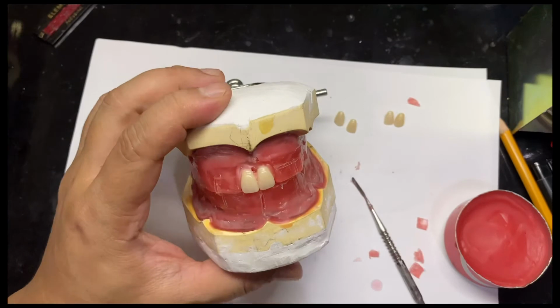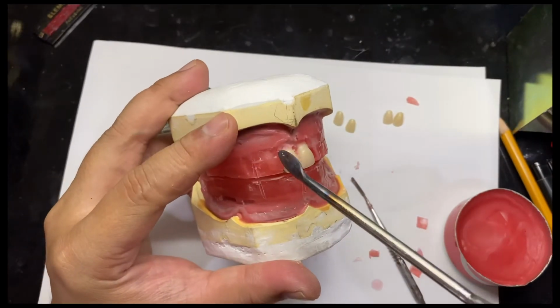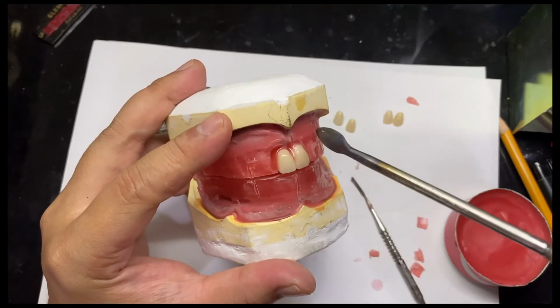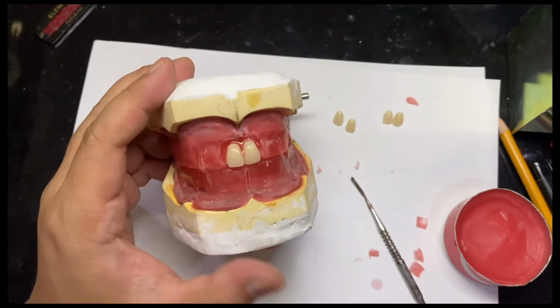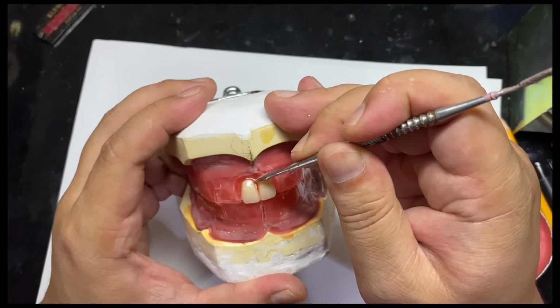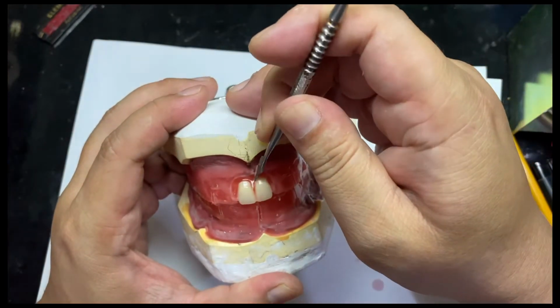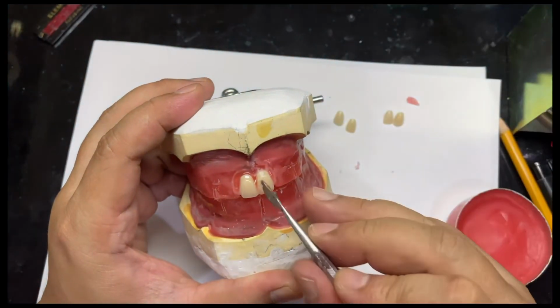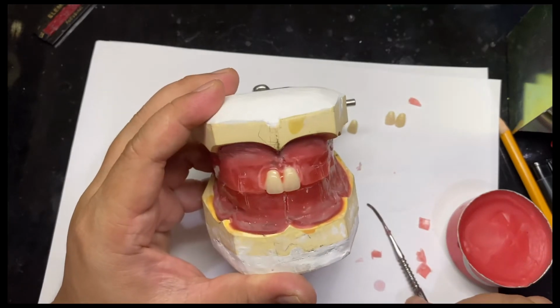For you to be able to do that, you have to soften a little bit of wax on the mesial and distal side, so that you'll be able to fix it there, and then this area a little bit there. So that's for the two central incisors.